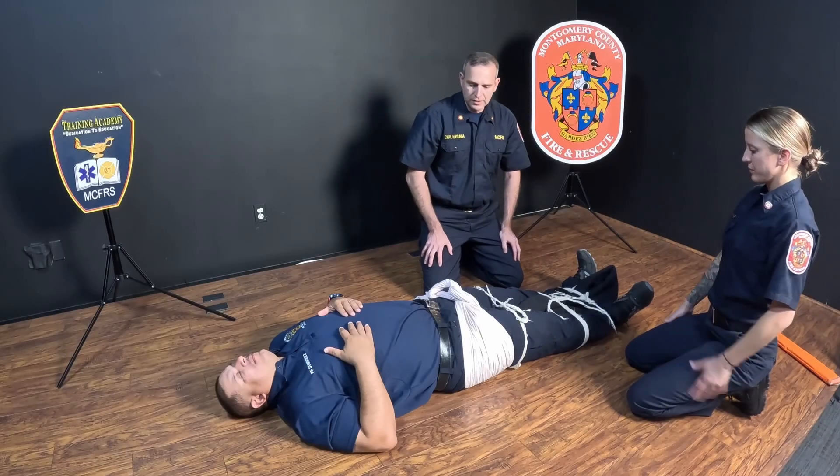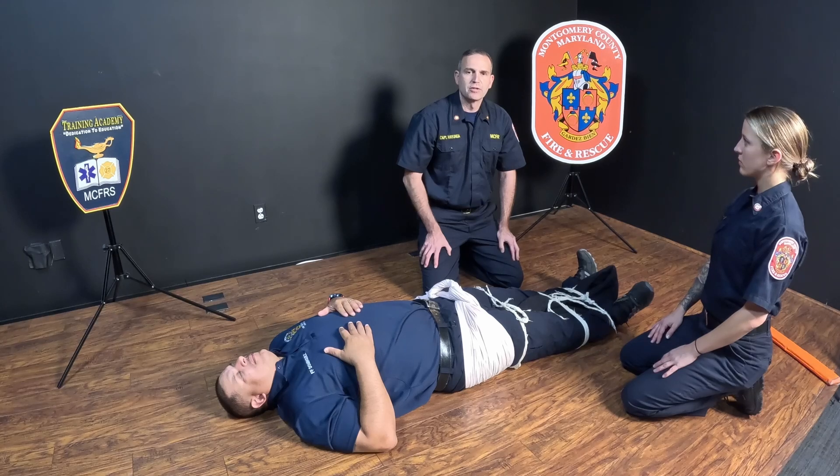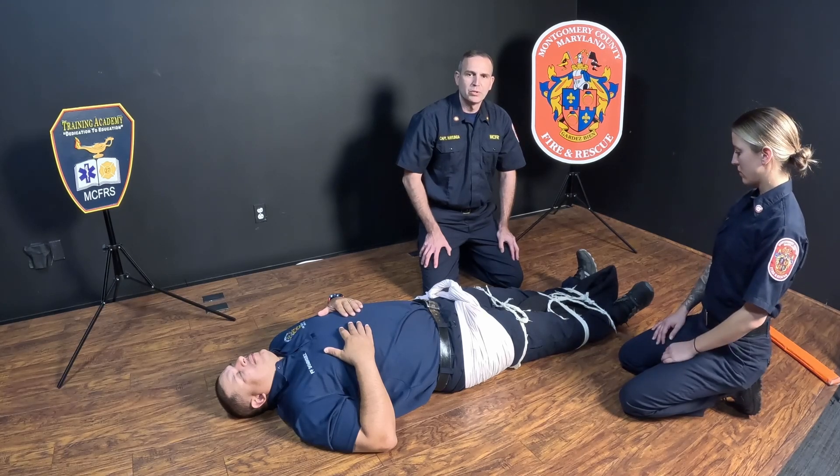Once the patient is secured, we will put them on an orthopedic stretcher and secure them to the orthopedic stretcher, after which we will check the patient's pulse, motor, and sensory to ensure that none of that has been compromised.